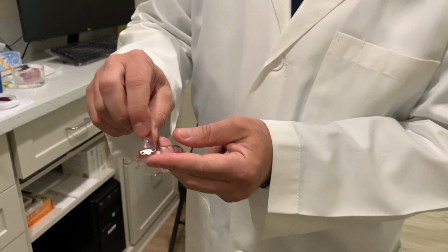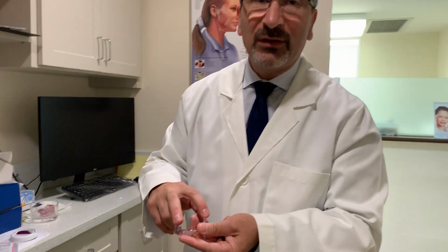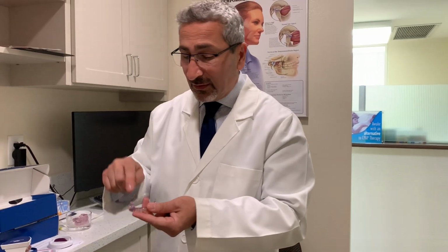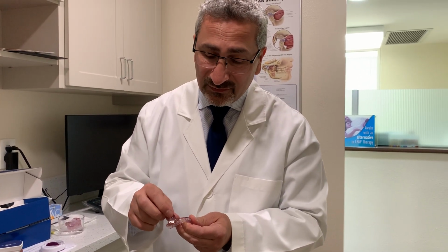And so when you change one side, you're at zeros on both right now. When you're gonna advance, you're gonna take the two ones and make sure you put them correctly. Make sure the writing is on the outside and the flat end is to the back, because every once in a while somebody puts it on backwards.